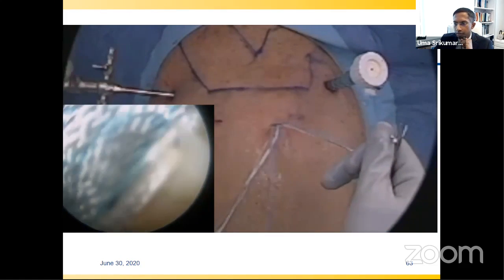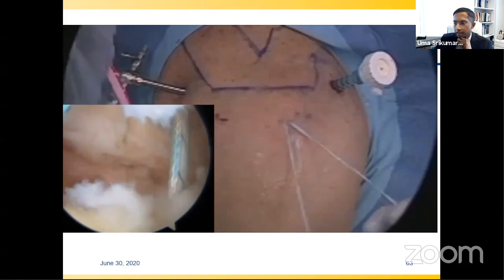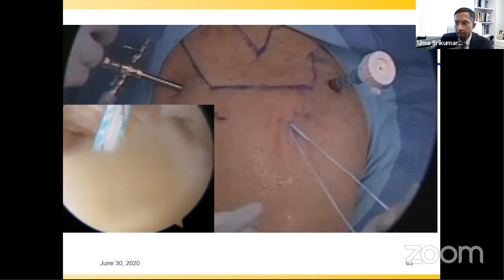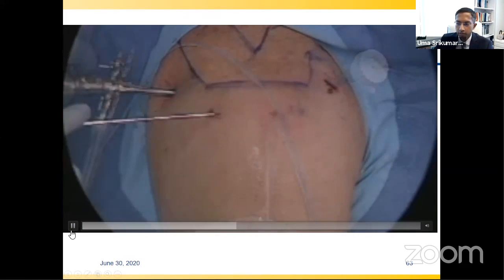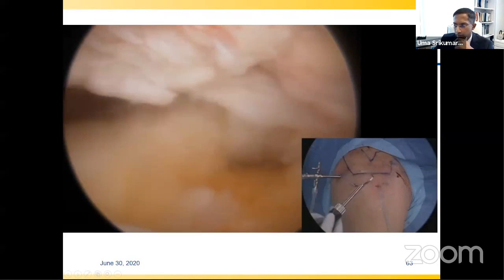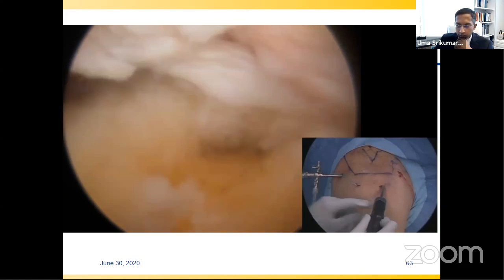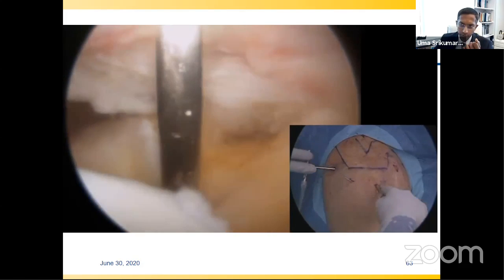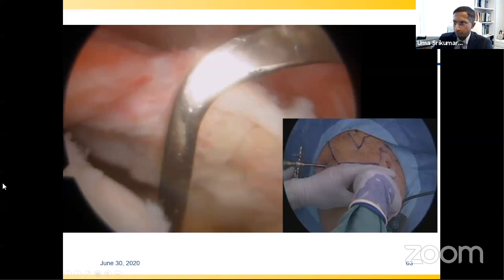So we're doing this first in the posterior tunnel. You can see that they're sliding through the tunnel, one exiting laterally here, and then the superior sutures for repair, they're exiting superiorly. So we're relocating those in the back posterior lateral tunnel, and then we're going to repeat our steps with the tunneling device to place a second anterior tunnel. So this would normally require 2 medial row anchors, so we're placing 2 medial tunnels.